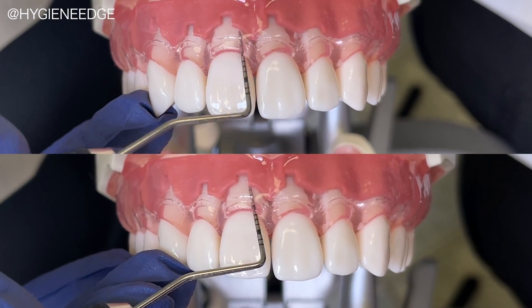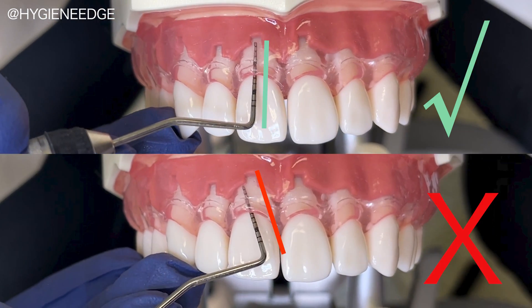The clear gingiva also help you to see if you're keeping the probe in line with the long axis of the tooth subgingivally versus angling it across the tooth.